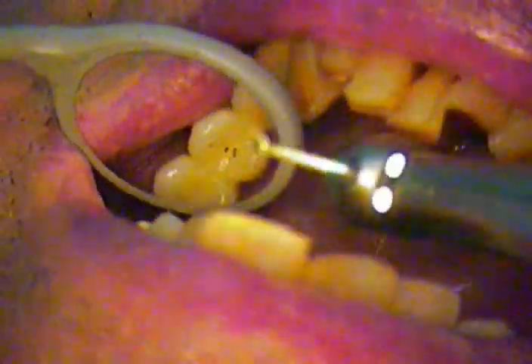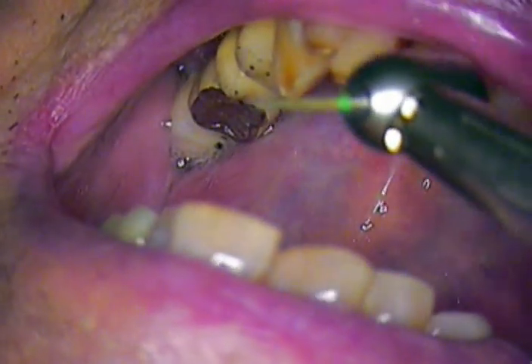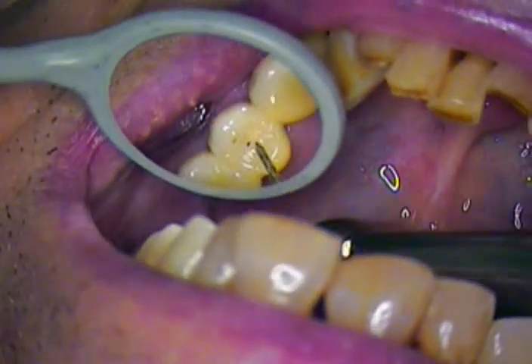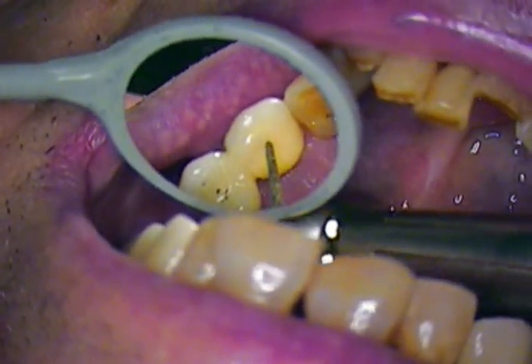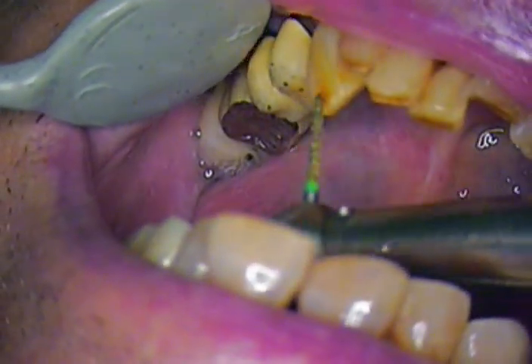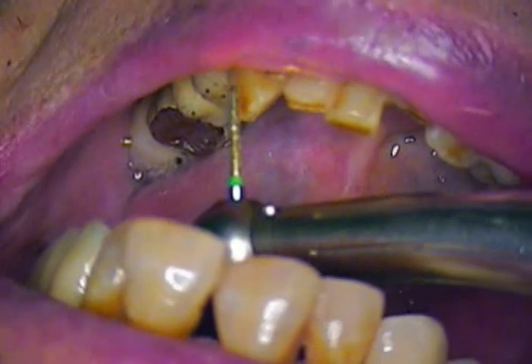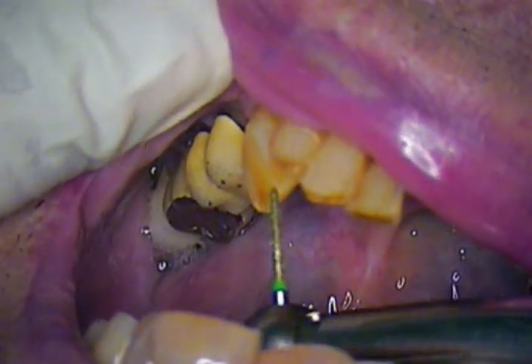We just adjusted the occlusion so that we're light in bite. We want to lighten the load on the pontic. We want it a little heavier on the bicuspid and we definitely want contact on the cuspid. So the first bicuspid and left side will both be in contact. We're going to score the surface on this lower cuspid, and we're doing this without anesthetic.